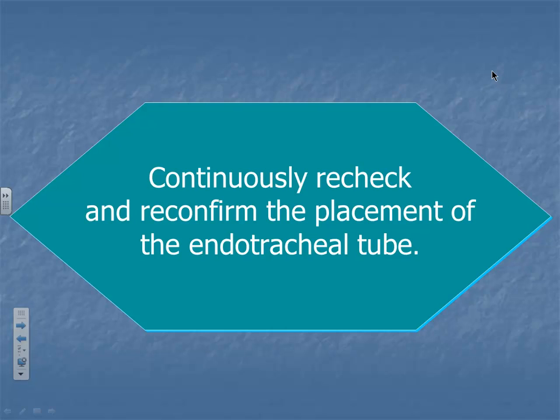Your sats start dropping. All right, what does the E stand for? Haven't heard it yet. Nope. That starts with an A. Anything else? Okay, E is equipment. So you can have equipment failure. Could be your oxygen tank has run dry. Your BVM has developed a hole, and every time you squeeze it, the air goes out somewhere else. So anyway, kind of go down this mnemonic, and it may help you problem solve why your patient's O2 stats are dropping or whatever. Okay?